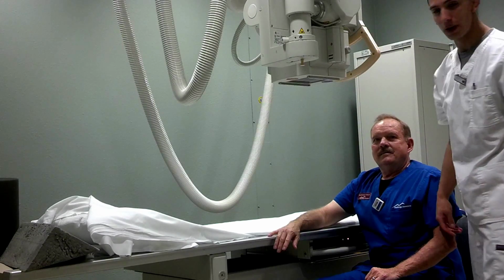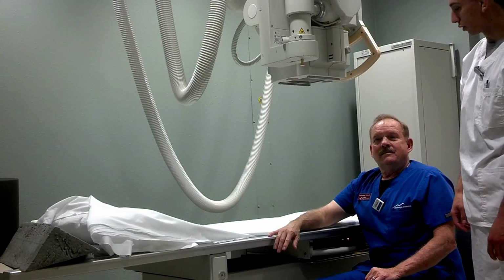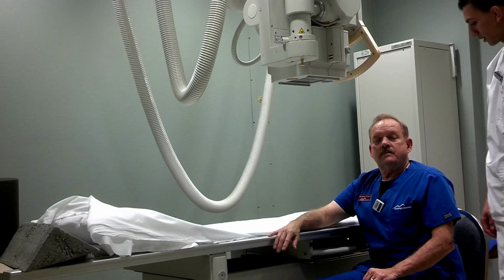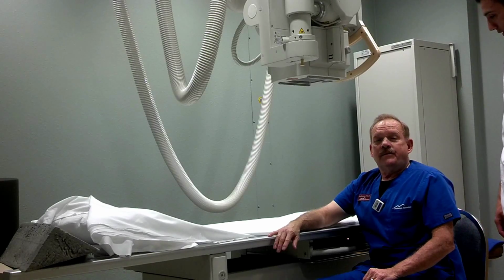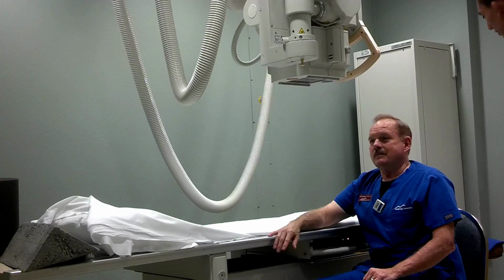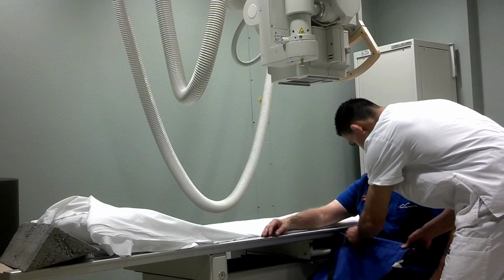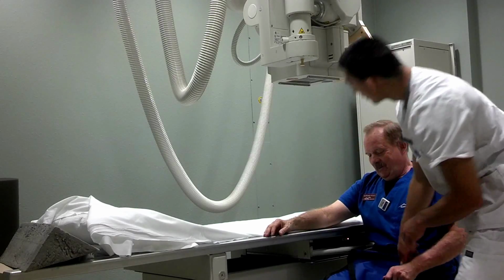So we're doing our superior inferior axial shoulder view here. We have our patient here. Can you tell me your full name, please? Dan Orbeck. And your date of birth? 5161. Perfect. All right. We have our shield here. We're going to lay this on your lap here just like that.